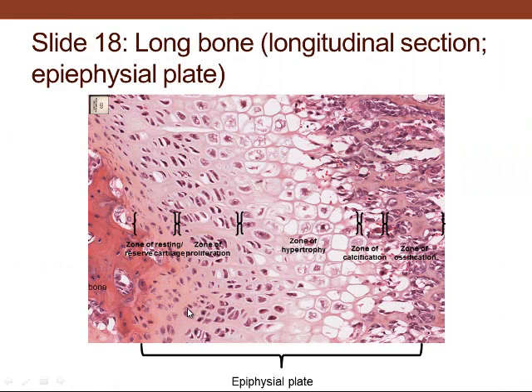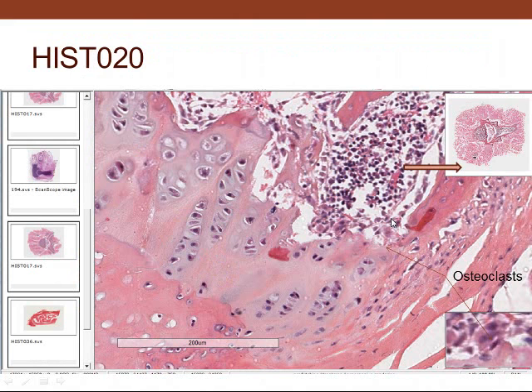So also, if you look at hyaline cartilage right next to bone, so this is bone here and this is bone marrow, and so we got the growth of the cartilage at the epiphyseal plate. Since bone doesn't grow from within by interstitial growth, but cartilage will, cartilage uses interstitial growth and then differentiates into bone. And so you have these different zones: zone of ossification, zone of calcification, hypertrophy, hyperplasia, reserve. So you have these different ones as this cartilage is differentiating ultimately to make bone over there.